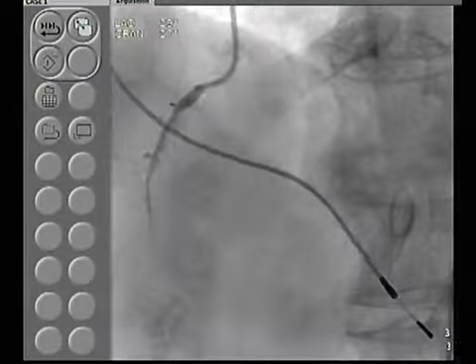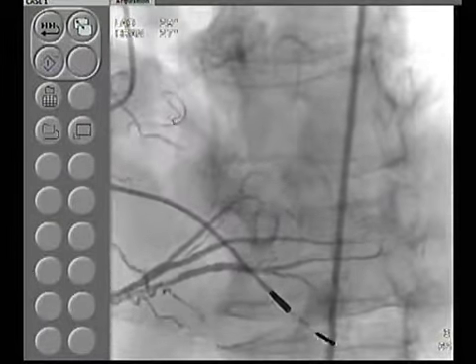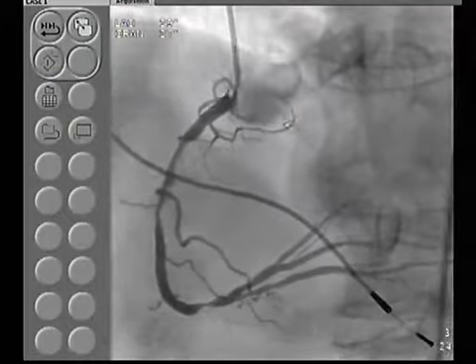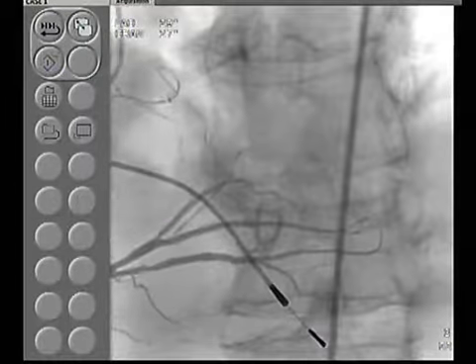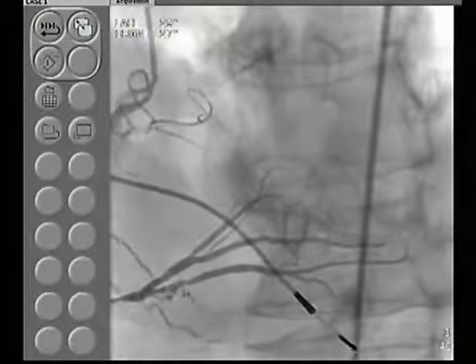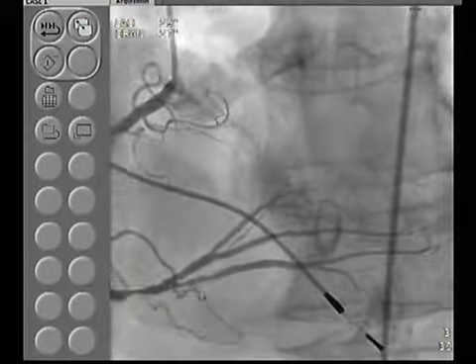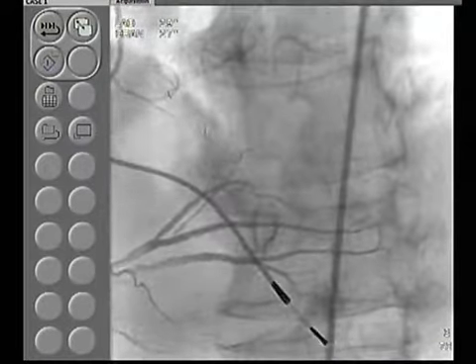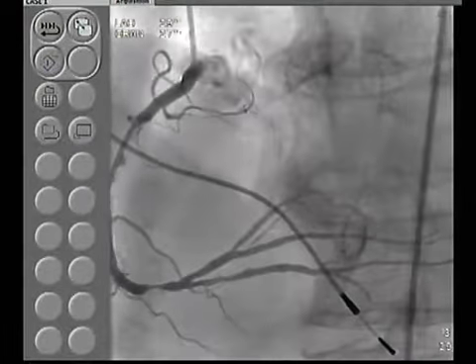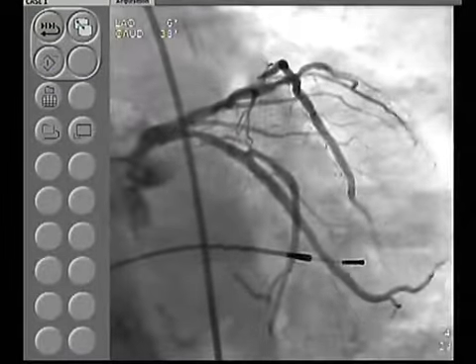years back. So this is the right coronary artery, calcific, with moderate to severe calcium, a proximal lesion of about 70-80% extending to the mid, and then there's a distal 90% lesion just before the bifurcation of the PDA and AV continuation. And again, the same PDA, you see the ostium 60-70%, moderate size disease in a moderate size vessel.